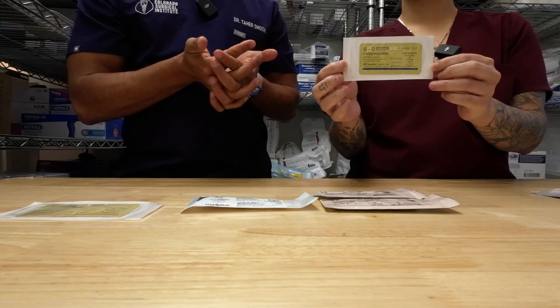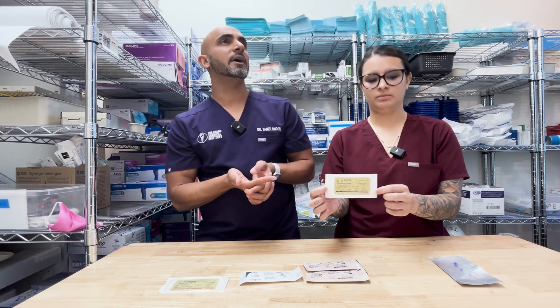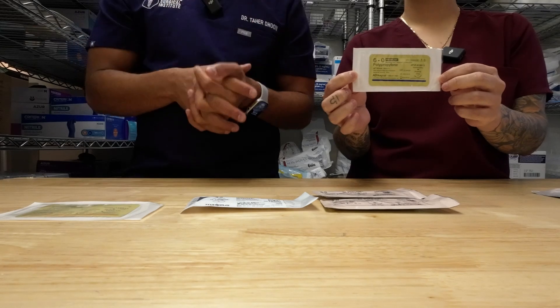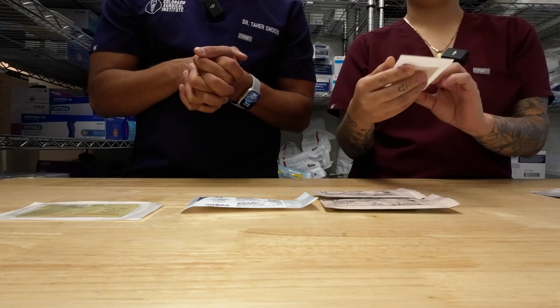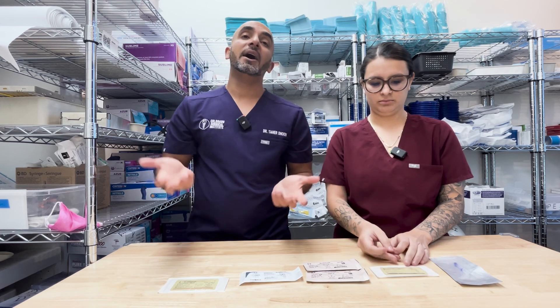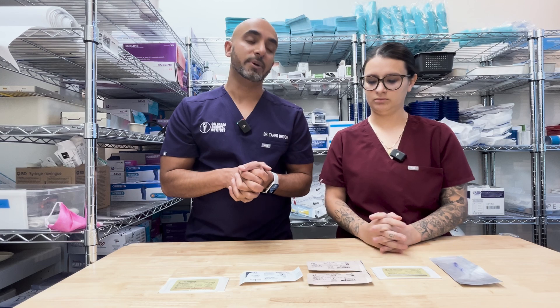Do we use it anywhere else really? No, this is more for cosmetics. We used to use it over blocks, and now I just use my glycolon over the blocks and I don't really have incision line opening. But maybe have a box of it — the shelf life is really long and it's a good suture for really finesse moments.